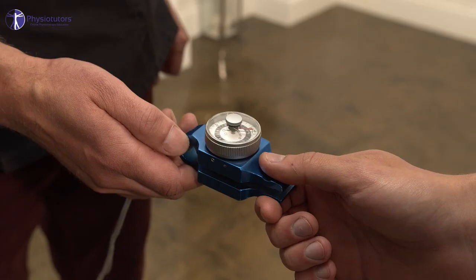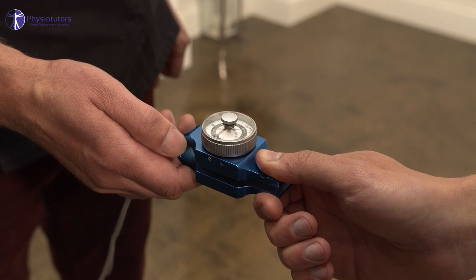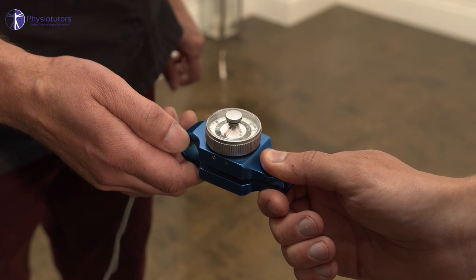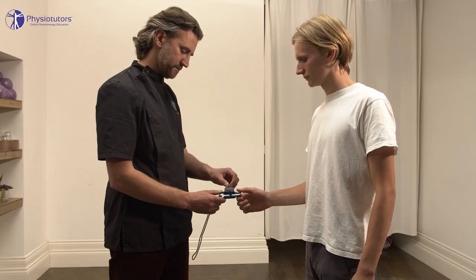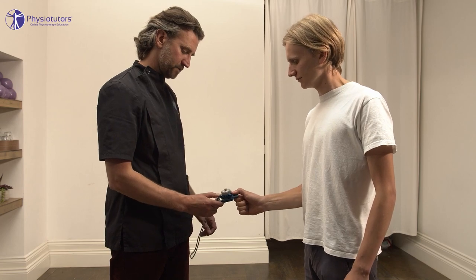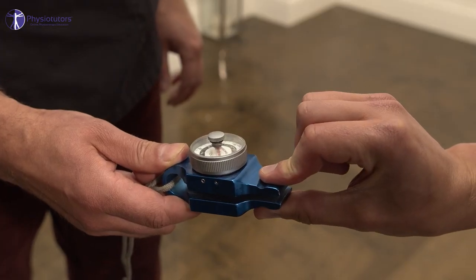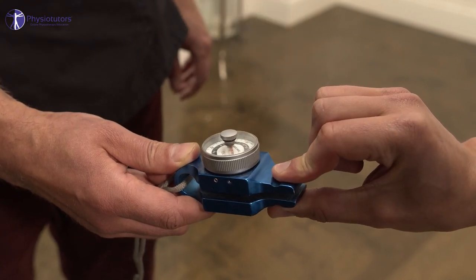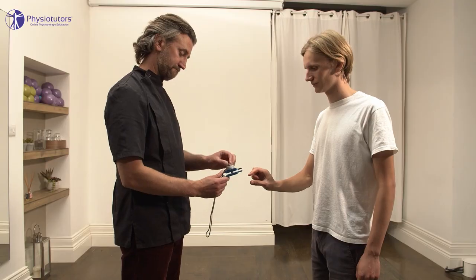Finally, I also recommend the use of a pinch dynamometer, which is really nice for two of the most functional grips we have in the thumb: key grip and pinch grip. There are over 16 types of grip in our hands, but these are the main ones used functionally. If you're looking to become research active or do audits, it's money well spent to get a pinch dynamometer as well as a gross grip dynamometer. I'd also recommend taking your bathroom scales to clinic so you can set some markers there.